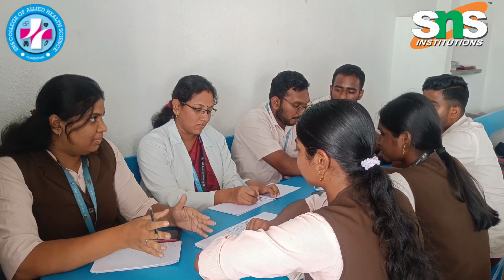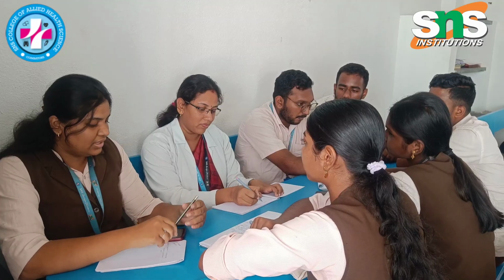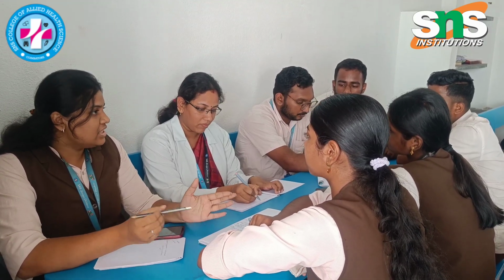Hello everyone. My topic is partial cardiopulmonary bypass. So, what do you think about this topic? What do you think that means? Like partial, not complete. Full bypass versus minimal bypass. Yeah, partially heart and lungs. We are not going to do a full cardiopulmonary bypass here, but in a small way. It is a technique where the patient's blood flow is diverted from the heart.